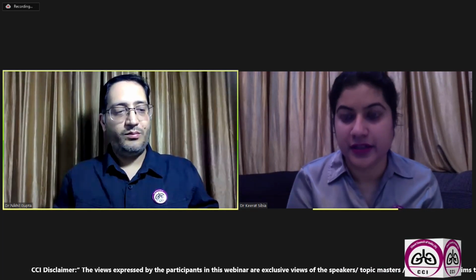Right. So I'd like to take this question from Dr. Vishal Randhawa Arya from Meerut, Uttar Pradesh. Sir is a very revered senior physician. So sir is asking how to differentiate on chest X-ray. Basically, he's asking how to pick up miliary tuberculosis and ILD on chest X-ray. So sir is asking you two questions. And actually, I would like to club this with another question.